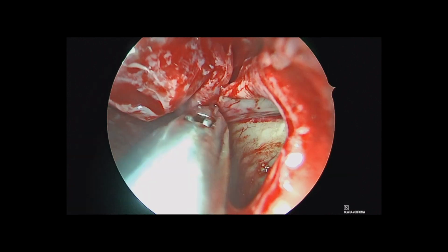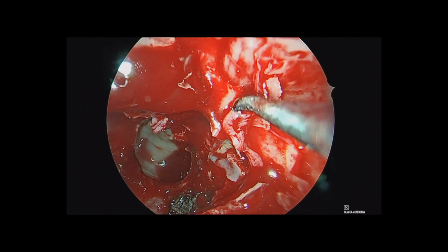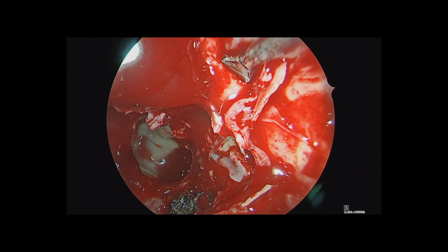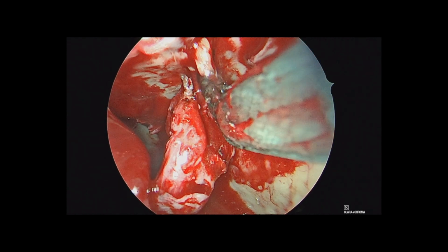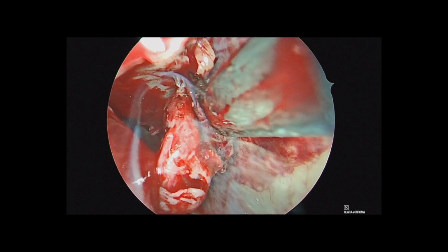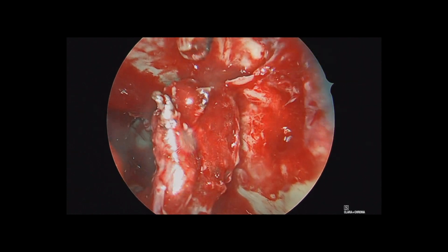Here we are turning our attention back to the orbital floor and dissecting out that nerve as it goes back towards the pterygopalatine fossa. Removing some bone of the infraorbital canal, as you can see there, and then taking care of some mucosa on either side with a bipolar cautery, and trimming back that soft tissue to resect this nerve en bloc.